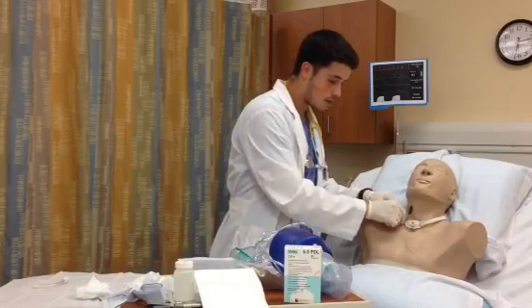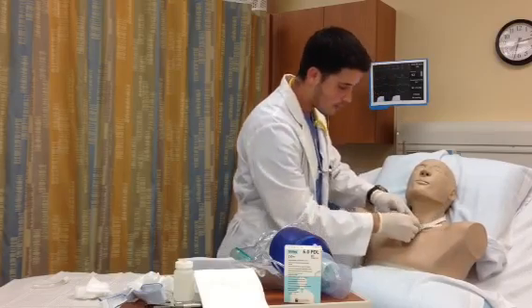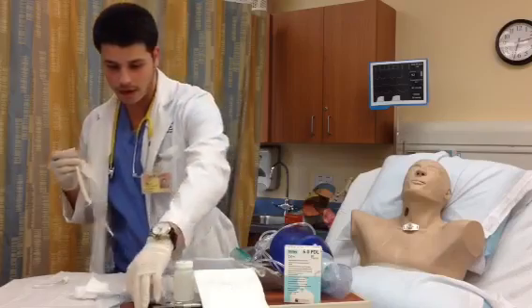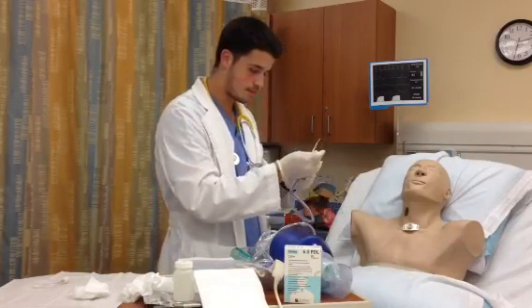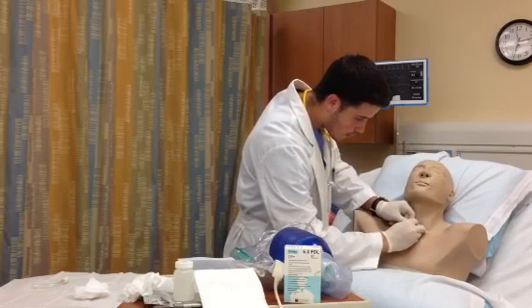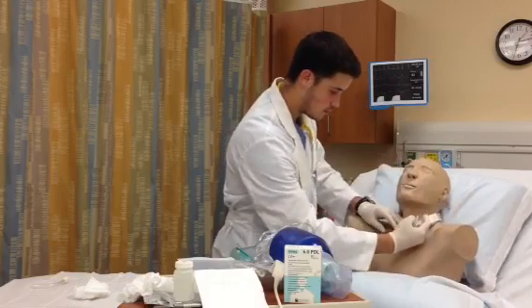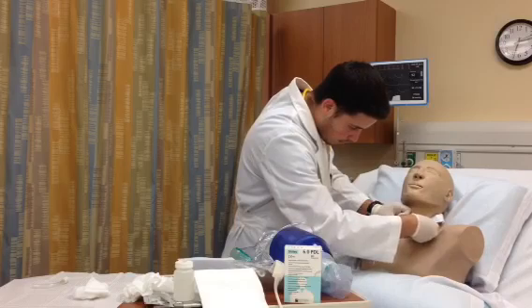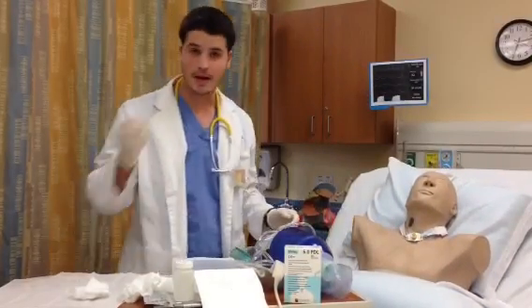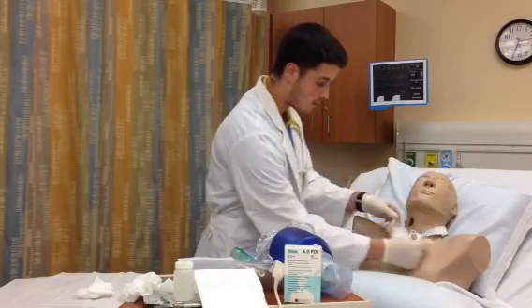Now we're going to remove his old and dirty necktie. Holding onto the flange. And we're going to place new ones. We're going to replace back his inner cannula, lock it, and put a new pre-cut 4x4 gauze to keep everything dry.